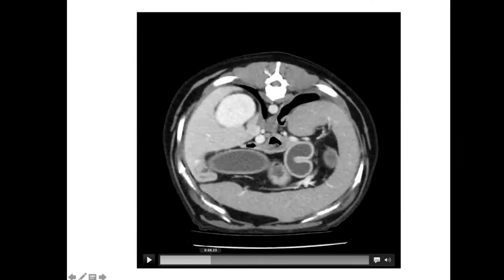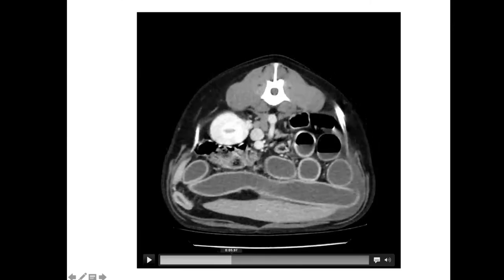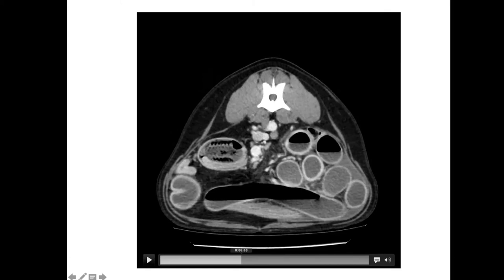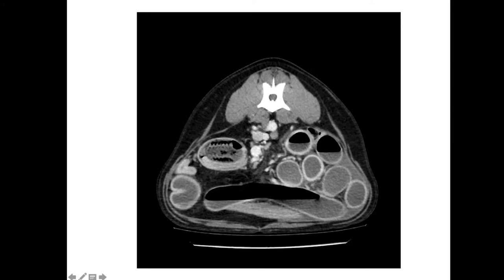This is a fairly recent case from LVS. One of the most significant things, apart from all these dilated loops of bowel, is this structure here — I'm not sure if you can see my pointer. That really shouldn't be there. If you spend a bit of time scrolling cranially and caudally, towards the mouth all these loops of bowel are big and dilated and gas-filled with a whole bunch of fluid; towards the colon and rectum it's completely empty. Once you've seen one of these you'll never forget it on CT — it has a very characteristic appearance. Would any of you like to hazard a guess as to what this is? It's a pretty common intestinal foreign body, and this being a Labrador, it may have been consumed after a barbecue.